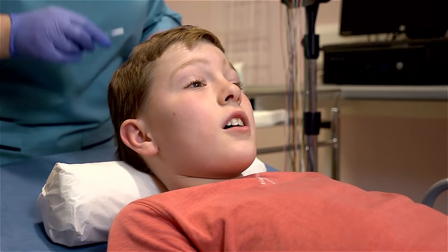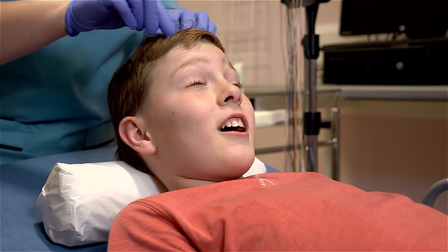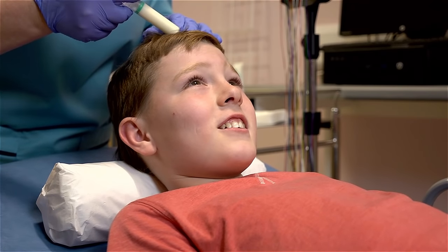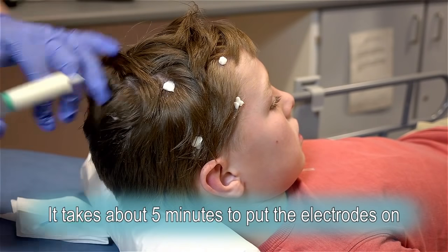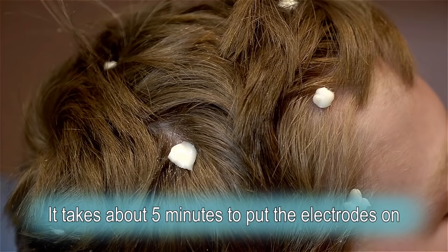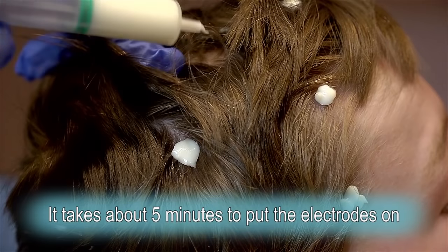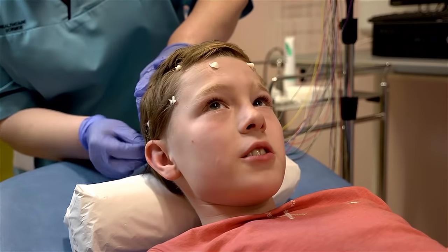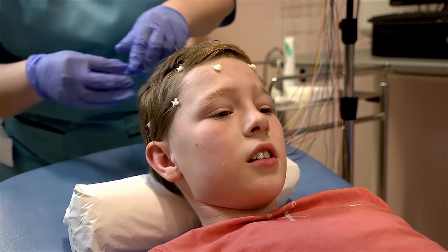You'll feel me rubbing with some gel first — the cotton bud that I showed you. I've got 21 of these to put on so it takes me about five minutes just to get them all on. How long is this going to take? Once I've got all these on your head, it will take 20 minutes to do the recording.